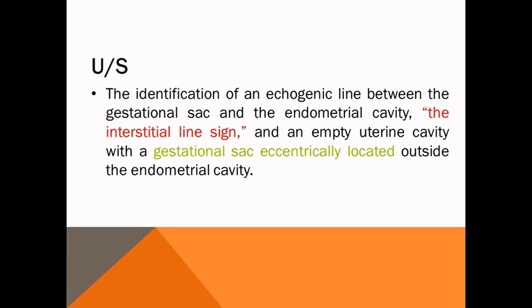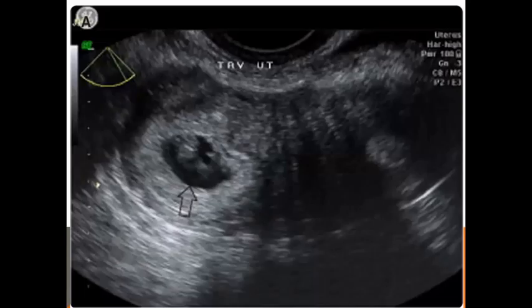Diagnosis is difficult by ultrasonography. We should show an echogenic line between the gestational sac and the endometrial cavity. The sac is outside the endometrial cavity in the lateral aspect — this is called the interstitial line sign — with an empty uterine cavity. We notice the gestational sac is eccentrically located outside the endometrial cavity. This is the endometrial cavity and this is the sac.